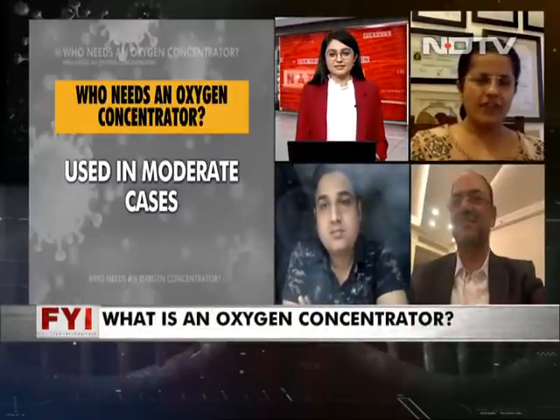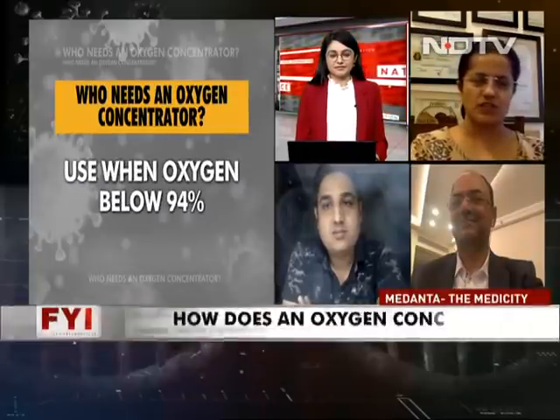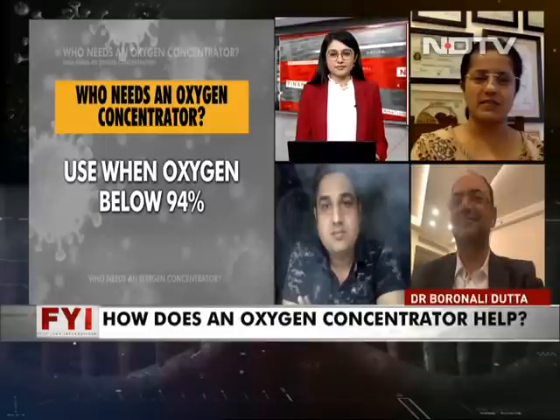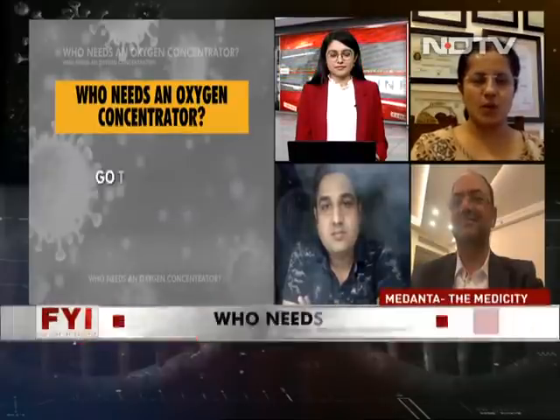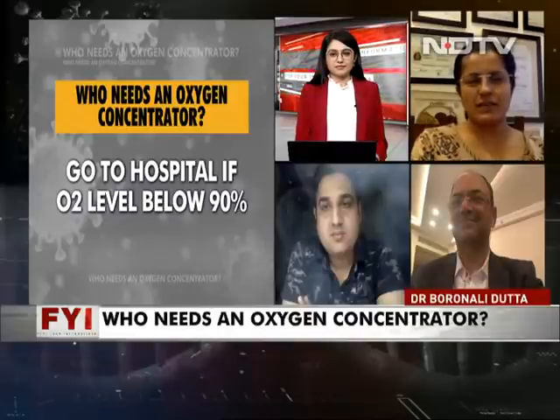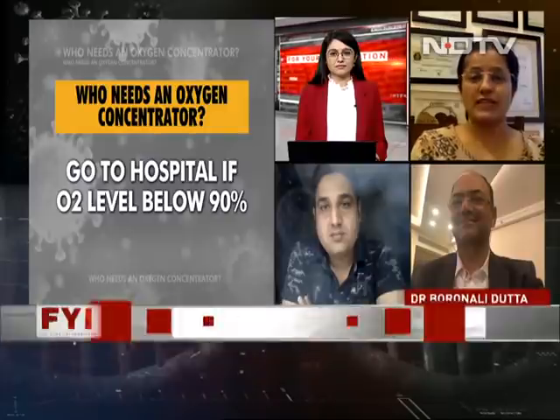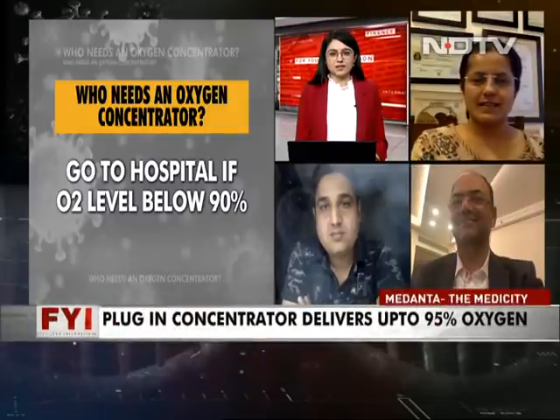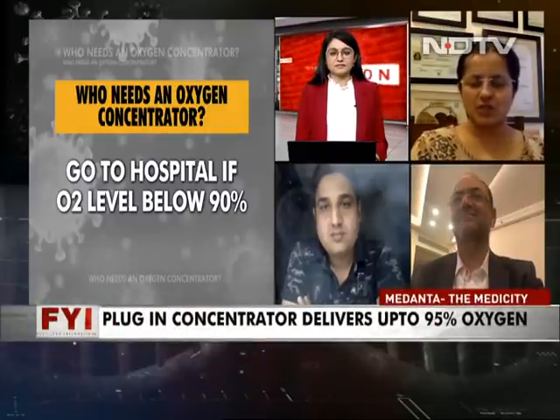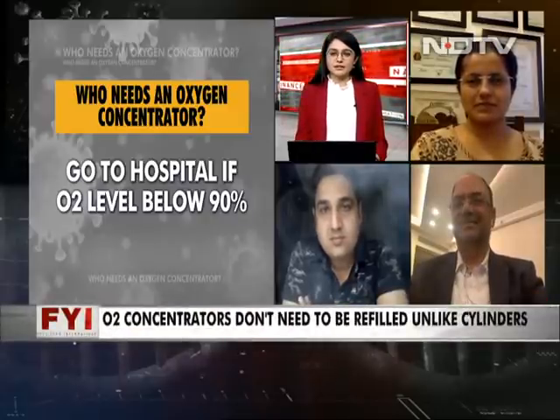Right. So I think definitely for people who are vulnerable, it is very reasonable to keep an oxygen concentrator at home. People who have elderly parents, definitely, or any other comorbidity. Other than that, it's difficult to justify because yes, everybody's susceptible, but does everybody keep a concentrator and run the risk of more needy ones not getting it in this kind of situation where there's so much shortage? And can it be used for kids as well?